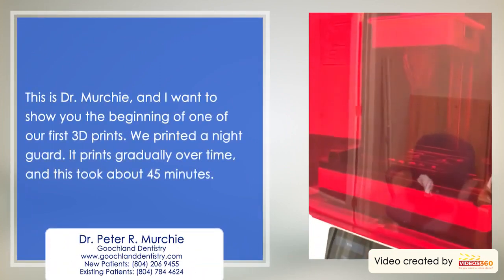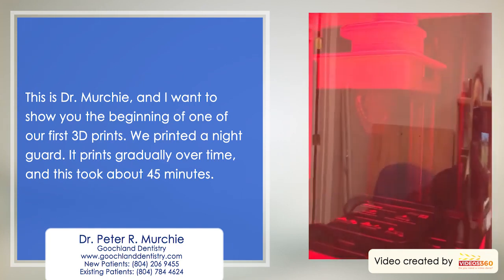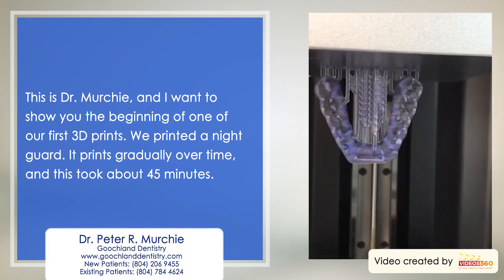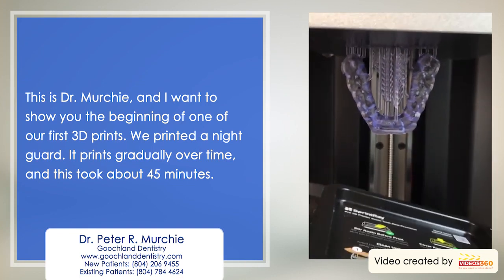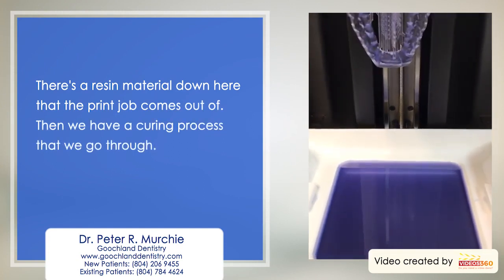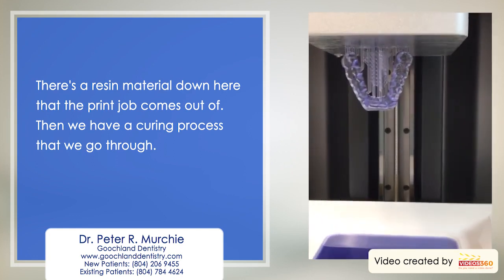This is Dr. Murchie. I want to show you the beginning. This is one of our first 3D prints. We printed a night guard, and what happens is it prints gradually over time, and this took about 45 minutes. And there's a resin material down here that the print job comes out of, and then we have a curing process that we go through after that.